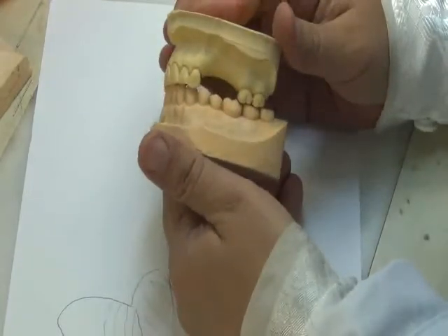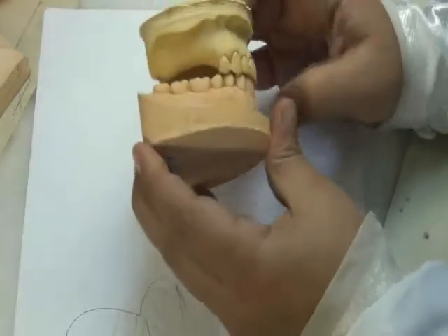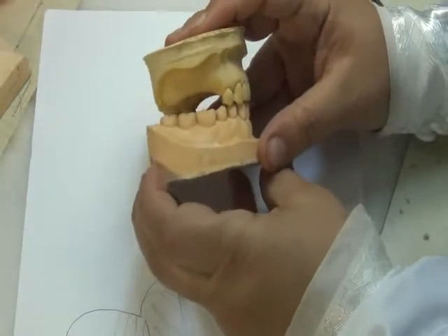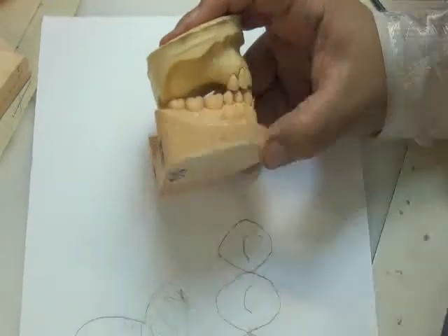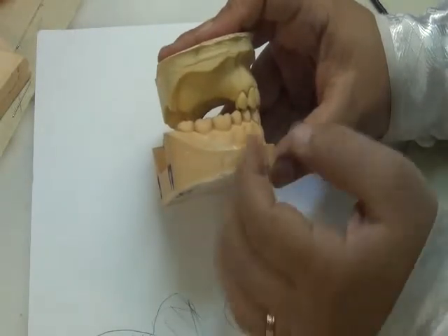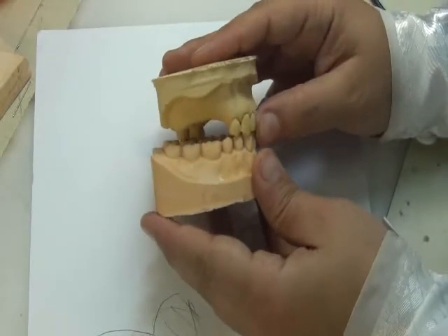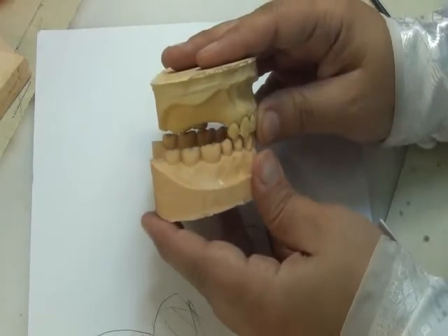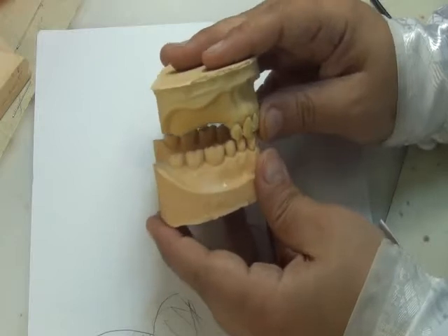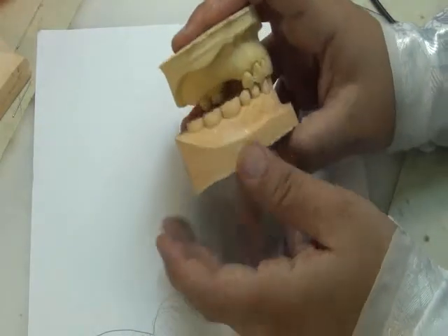Here we use the cast articulation, and we can simply put it on the articulator. But in this side, look how the casts are not stable when we have free-end saddles. Casts begin to move. Okay? This is not stable. I could set the teeth like this or like this or like this. I'm not sure how I should set the teeth. So in cases where we have free-end saddle, we should have a step that we call jaw registration.